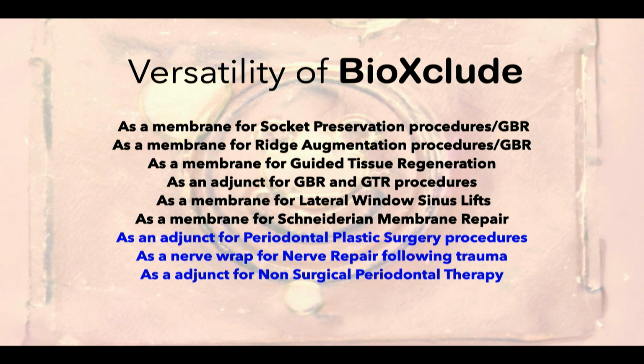There's something that goes against your training, I guess, of using this transparent membrane. It's so thin, and y'all showed a lot of cases where you use it as your sole membrane. I know you combine it with other membranes too, but I just wonder what your thoughts are about the resorption of the membrane, the residual of it, as compared to some more native or cross-linked ones. As a mono membrane, one membrane.